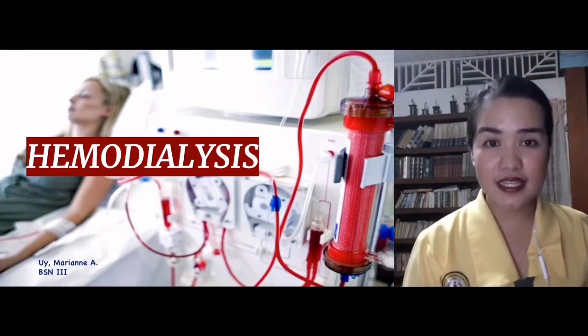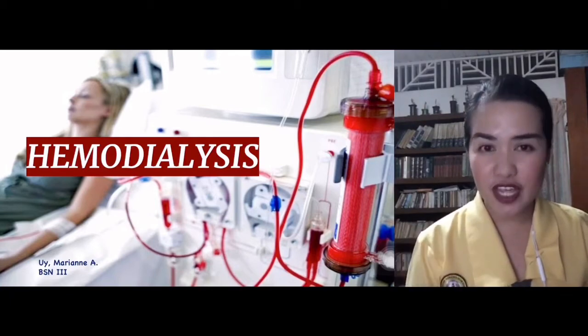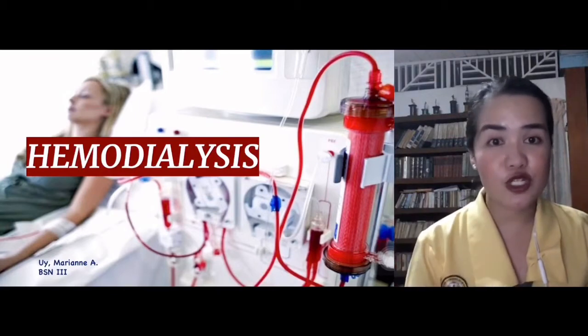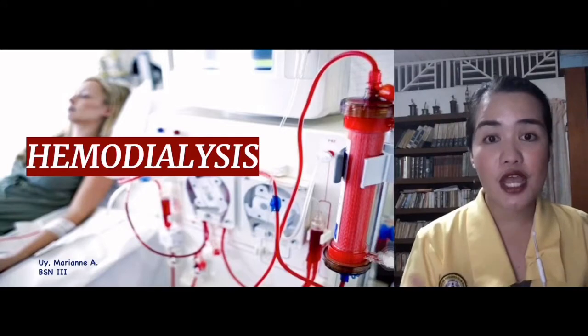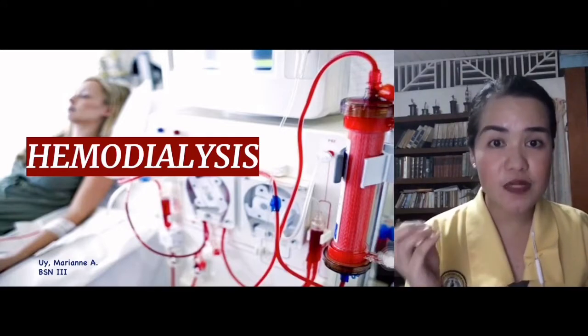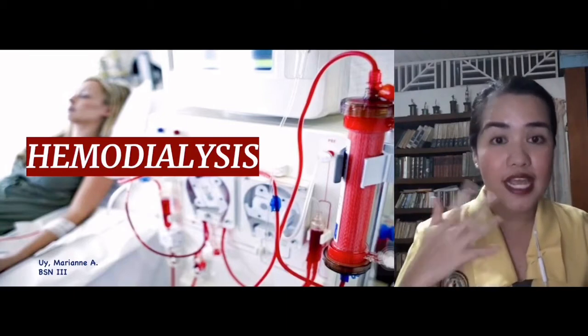Now, dialysis is done for patients with renal diseases, renal failure, or kidney diseases, in which their kidneys are no longer functioning properly or are functioning inadequately, which means their kidneys can no longer excrete the waste materials that need to be taken out of the body.